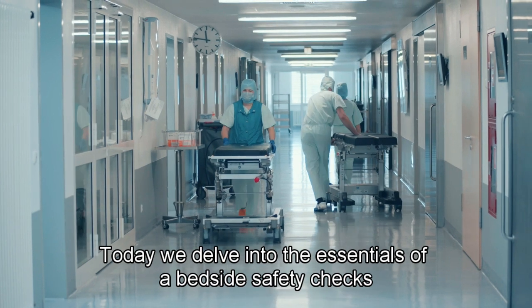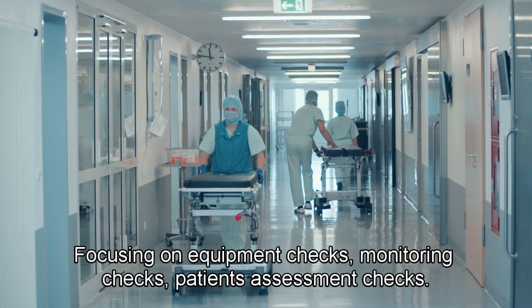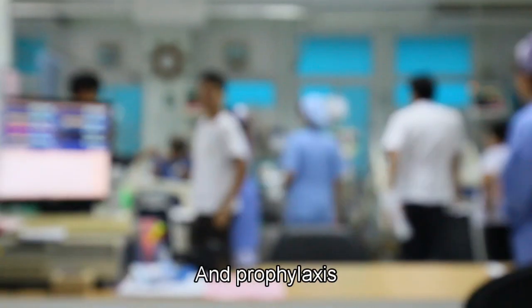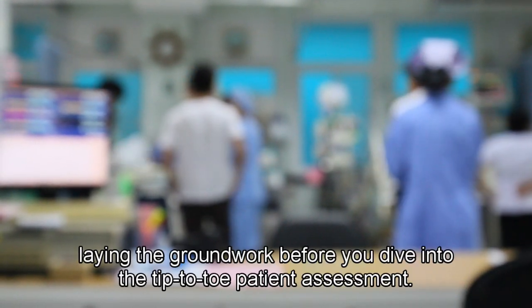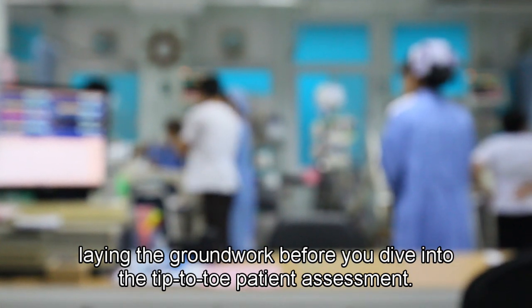Today, we delved into the essentials of a bedside safety check, focusing on equipment checks, monitoring checks, patient assessment checks, and prophylaxis. These four points are your go-to at the start of each shift, laying the groundwork before you dive into the head-to-toe patient assessment.